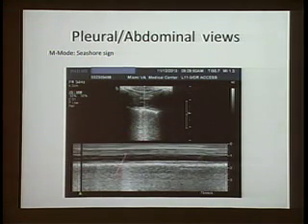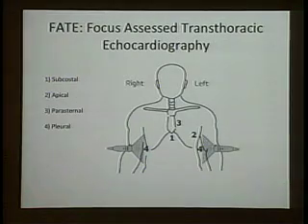And again, I'm going to go into some of the other views. If you do M mode when you're looking at the lung, there are going to be particular signs. I'm going to tell you. You need to get exposed to this terminology, particularly the residents, because this information is going to be coming in your exams. Okay? I think in the last in-training exam, there were a bunch of questions on echo views that were important for the test. So again, it's one of the things that we will review.